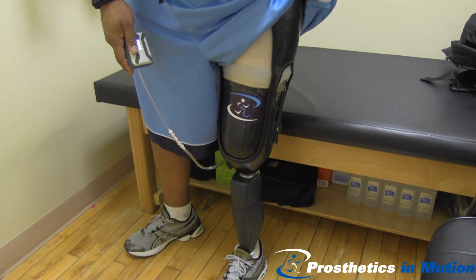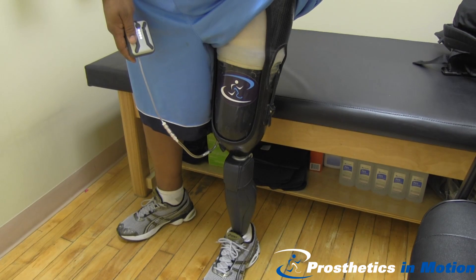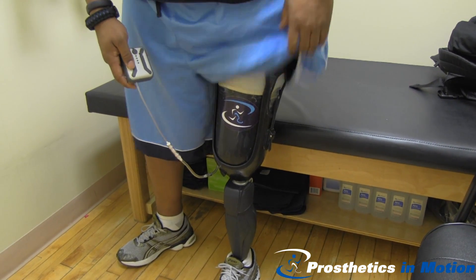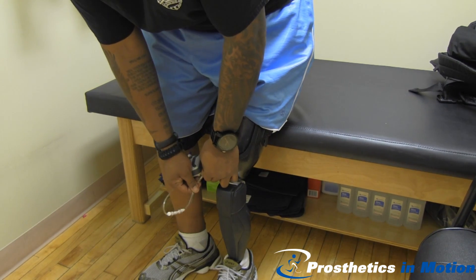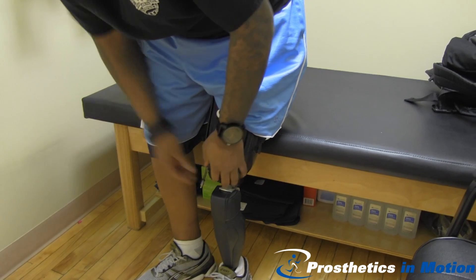How does that feel, Pete? Good. Feel it getting tighter? Yes. Since Pete has such a long residual limb, it just takes a longer time. There we go — he detaches it and turns the pump off. Now he has vacuum.